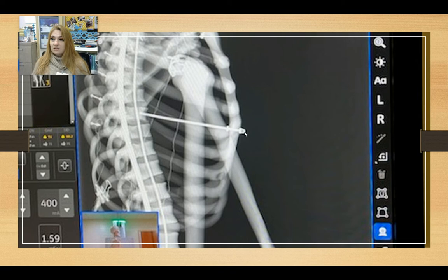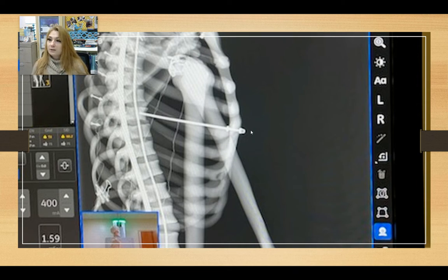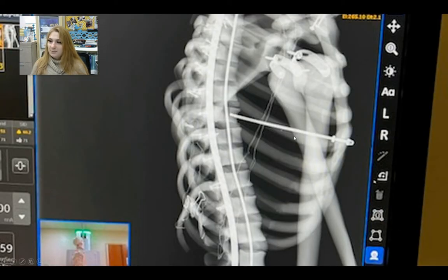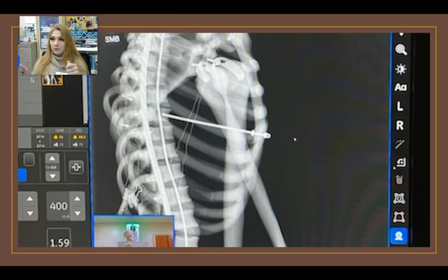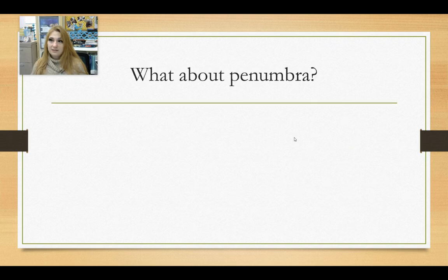So sometimes when you're positioning your patient, you do have to take that into account in real-life scenarios. That may differ a little bit from what you take your registry or CQR on regarding rotating the patient forward. But that is a real-life tip to help you get that perfect lateral chest x-ray. Here again is our patient right in the middle, and this next image was me rotating her forward slightly — it did fix it. It's a really great visual of what beam divergence is and how it affects us in everyday life.